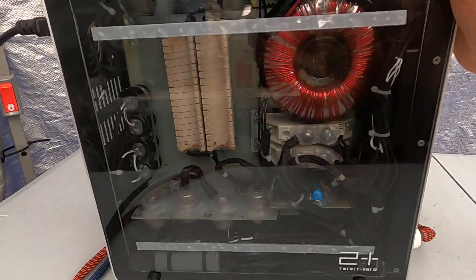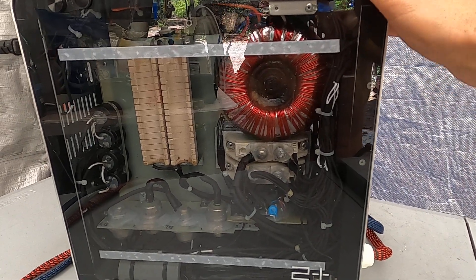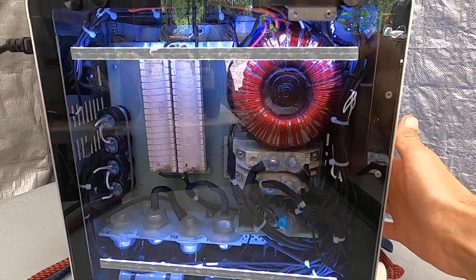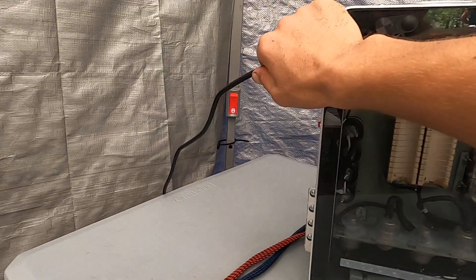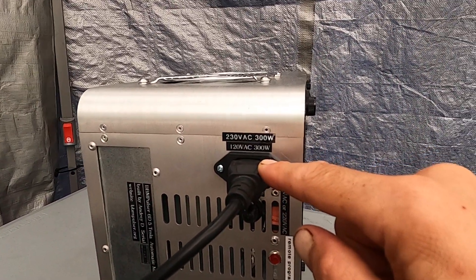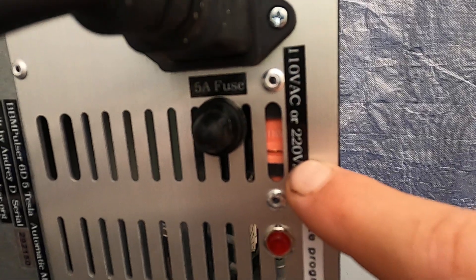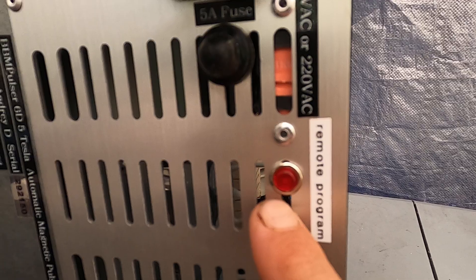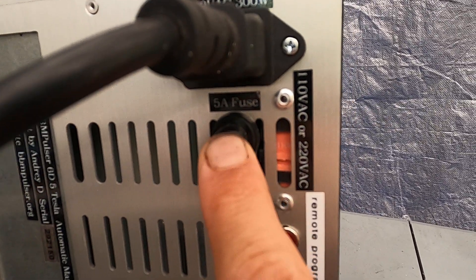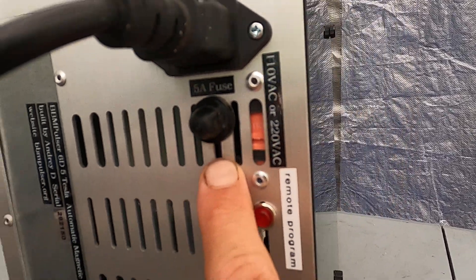Inside the unit — for now this model is not open source, but possibly will be in the future. I will be going into detail about what's going on inside and how it's built. I'm going to show you the back of it. This unit operates on either 110 or 220-volt AC. Here is the 110 or 220-volt AC switch. This is a remote program switch, and you have a remote in manual mode — you can trigger it. This is a 5-amp fuse that will be triggered any time there are issues inside the unit.